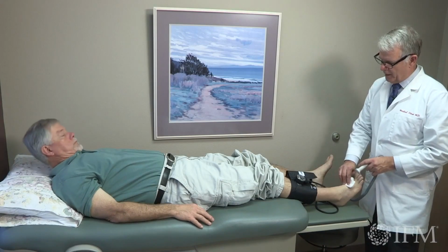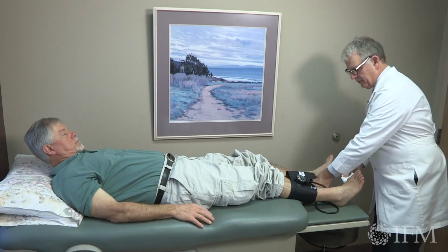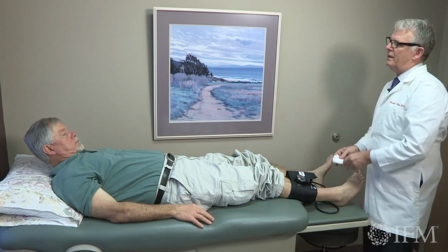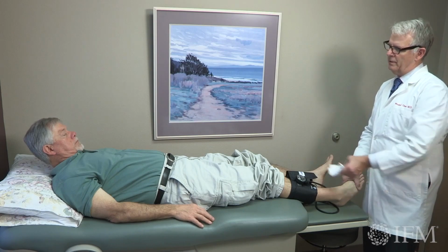Well, that's great, Steve. What I can tell roughly from comparing the blood pressure of your lower leg and your arm and their ratio is there's no indication you have peripheral vascular disease at all in your lower extremities. So that's good news.